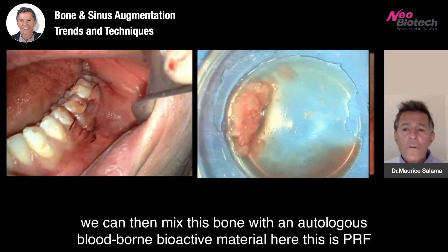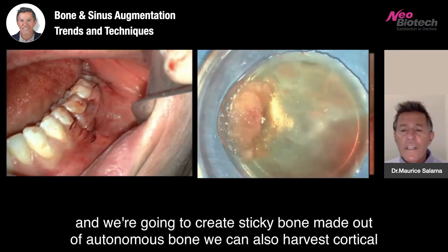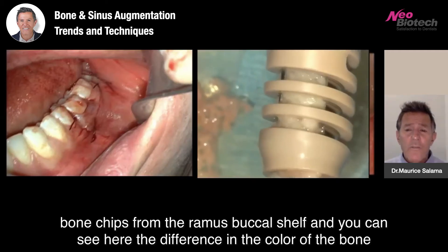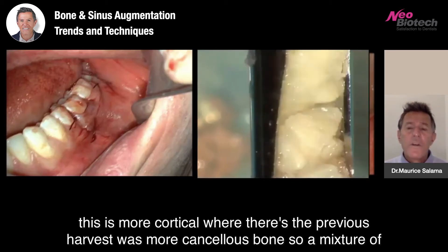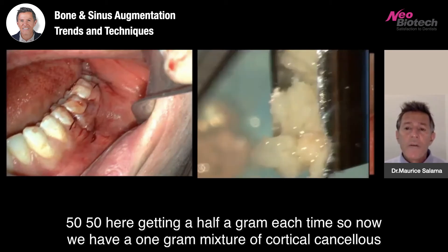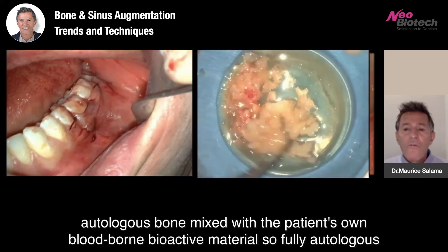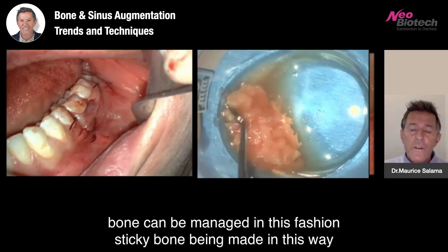We can then mix this bone with an autologous blood-borne bioactive material — this is PRF — and we're going to create sticky bone made out of autologous bone. We can also harvest cortical bone chips from the ramus buccal shelf. You can see here the difference in the color of the bone: this is more cortical, where the previous harvest was more cancellous bone. So a mixture of 50-50 here, getting half a gram each time, gives us a one gram mixture of cortical-cancellous autologous bone mixed with the patient's own blood-borne bioactive material. Fully autologous sticky bone can be managed in this fashion.